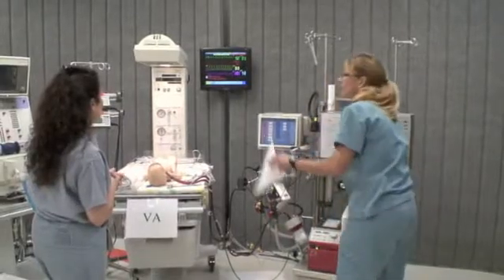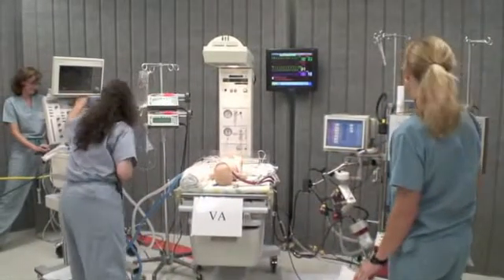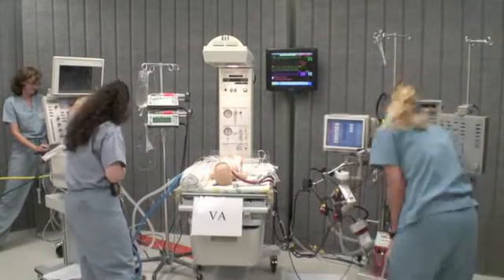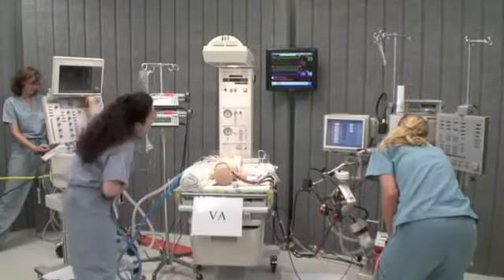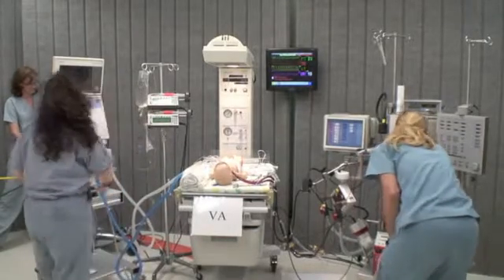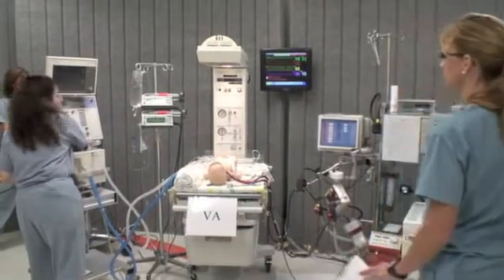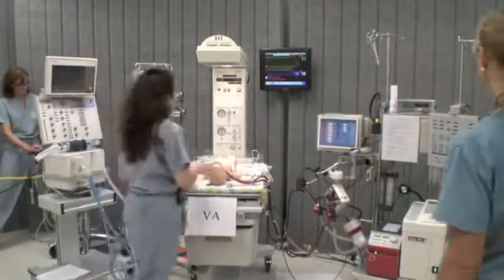Can you turn the FiO2 down on the ventilator? I'm going to control things over here. Can we get another set of gases? I'm going to start weaning my FiO2. We're back to rest settings from the vent. Everything looks like it's still working over here.